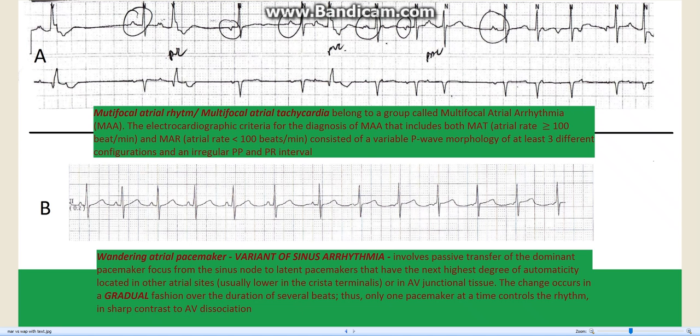Multifocal atrial rhythm or multifocal atrial tachycardia belongs to a group of rhythms called multifocal atrial arrhythmia. The electrographic criteria for the diagnosis of MAA, which includes both MAT and MAR, consists of variable P wave morphology of at least three different shapes or configurations, and irregular PP and PR intervals.